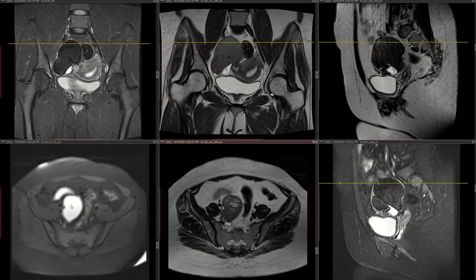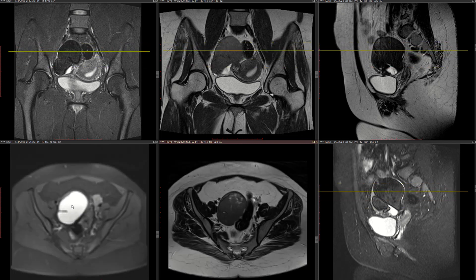The differential for this would be blood, because had this been fat it would have suppressed on T1 fat-sat. Had this been water, it would have been hyperintense on T2 and also hyperintense on STIR. So it is not water and it is not fat.